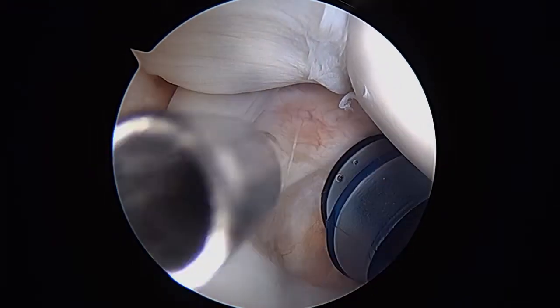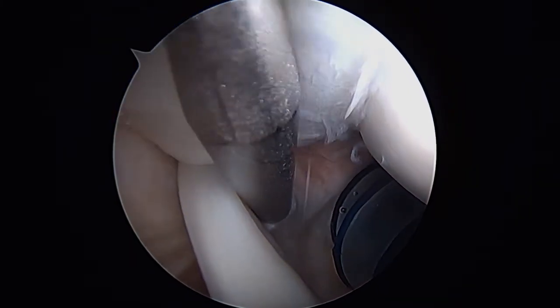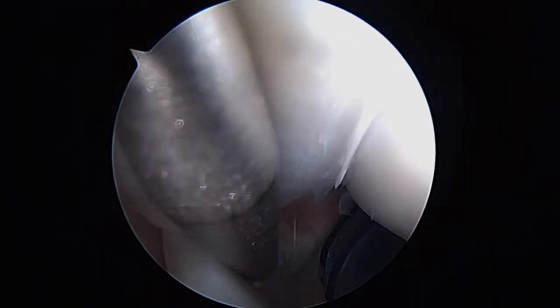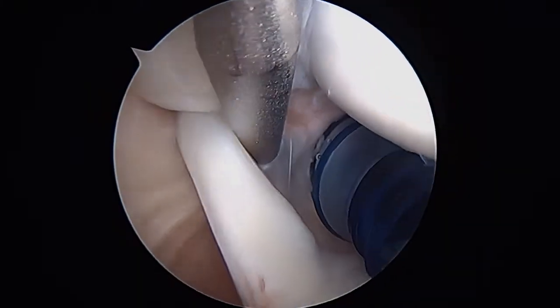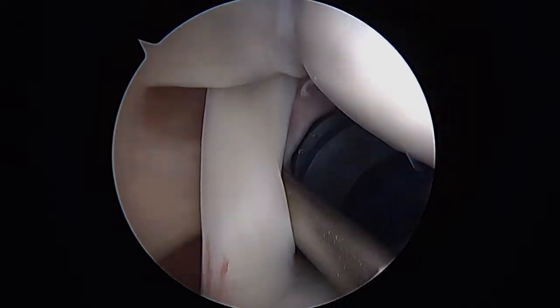This is your biceps tendon here — that looks good. Your rotator cuff is up above, and as we expected, your rotator cuff insertion here looks great. That's the undersurface of the rotator cuff, particularly the supraspinatus portion of it, and that looks good.